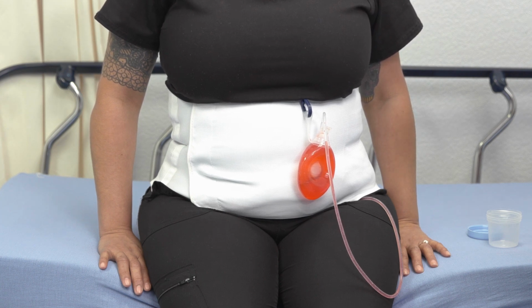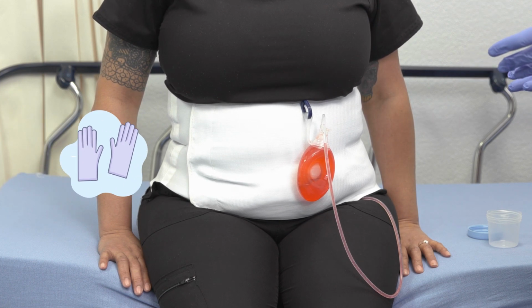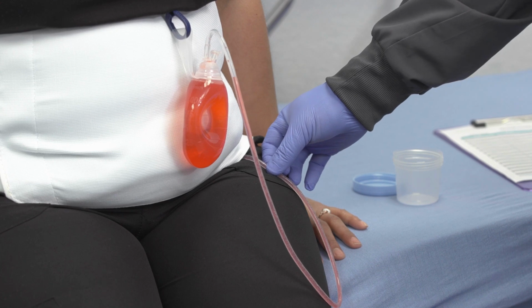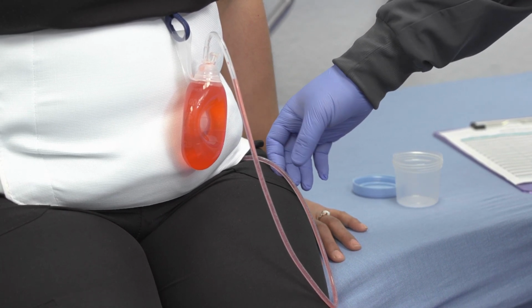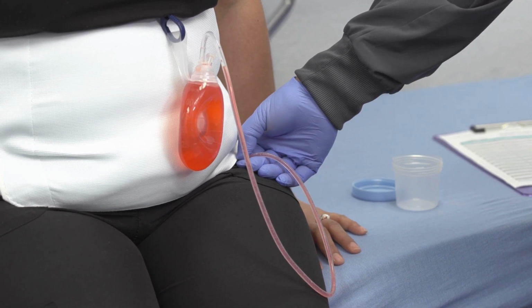Once the patient is comfortable and you have all your supplies staged, you're going to put on some gloves. Whichever gloves you have at home are fine, as long as you have gloves on. After that, you are going to visualize the lowest point of the drain that you can see coming out of either the surgical garment or the dressings. With one hand, you will grab that lowest point and hold down on it, keeping positive control.